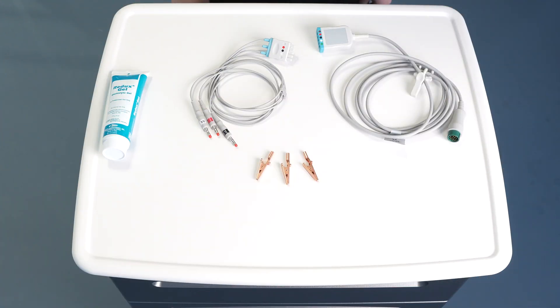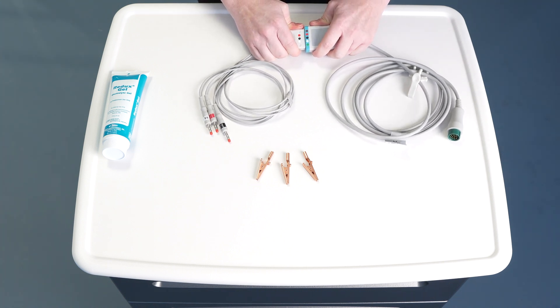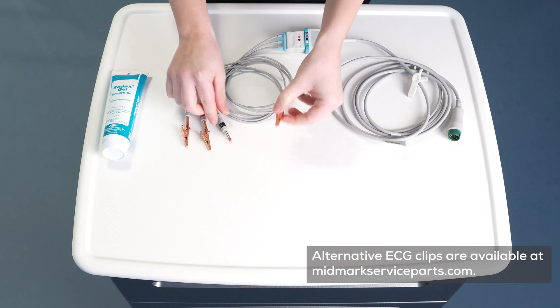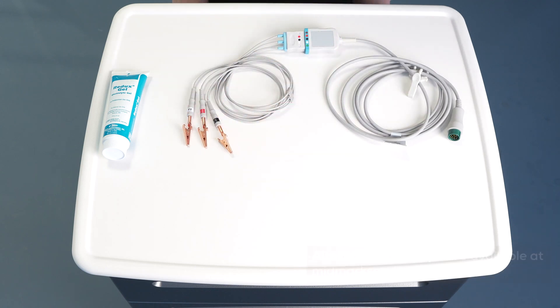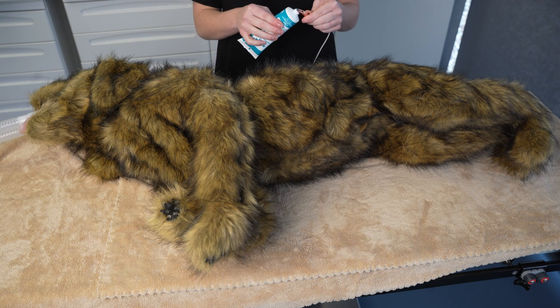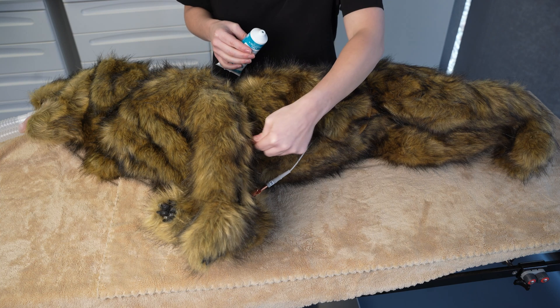Now the accessories can be connected, starting with the ECG. First, connect the lead wires to the ECG cable matching the color-coded dots. Next, slide the alligator clips onto the end of the lead wire posts. Then plug the cable into the ECG port located on the side of the monitor. To connect the ECG lead wires to the patient, apply redux gel to the alligator clips or directly to the patient, then connect the alligator clips to the patient.